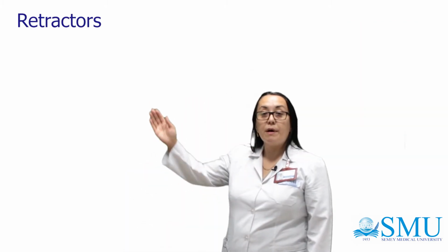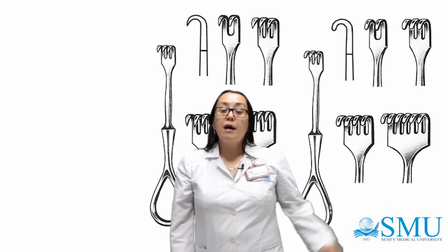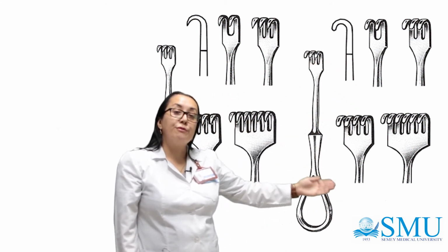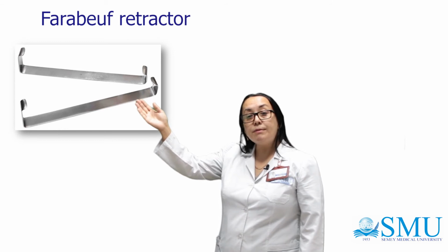Next group is retractors. These are the Volkmann's sharp and blunt hooks. They can be single-toothed, 2-toothed, 3-toothed, and 4-toothed. Next is Farabeuf's retractor, used for wound retraction.